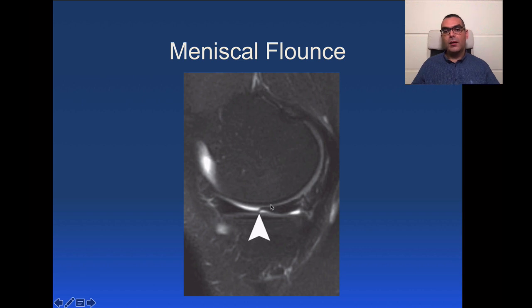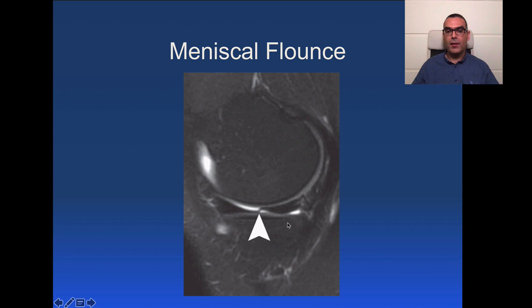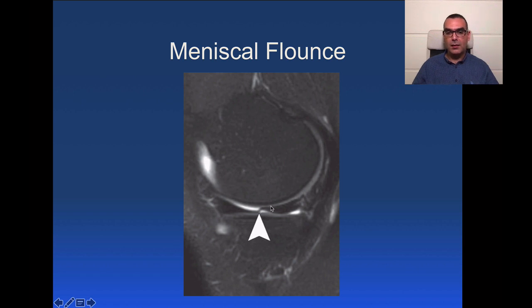Another commonly seen sign is the meniscal flounce sign — a redundant free edge of the meniscal body. This redundant appearance is very normal and is not a tear. It is more commonly seen when the meniscus is at the borderline of a discoid configuration. The bigger the apex of the meniscus, the more redundant it can appear, giving the meniscal flounce sign.